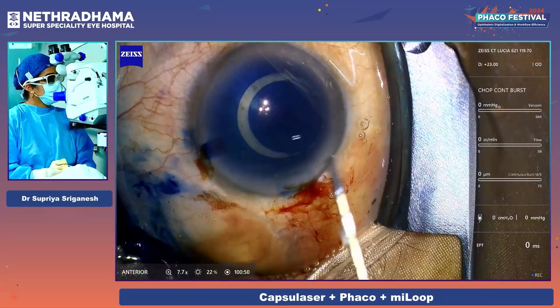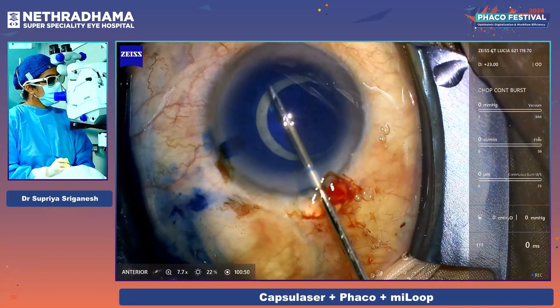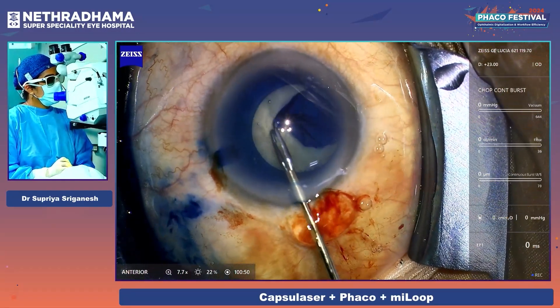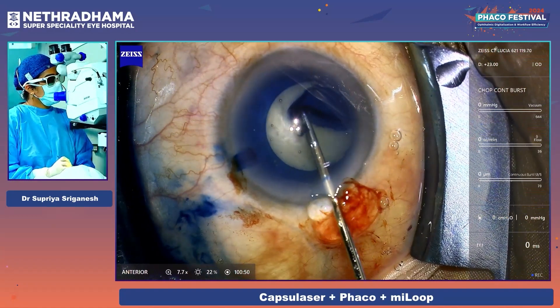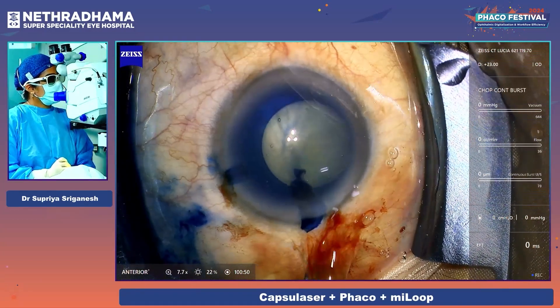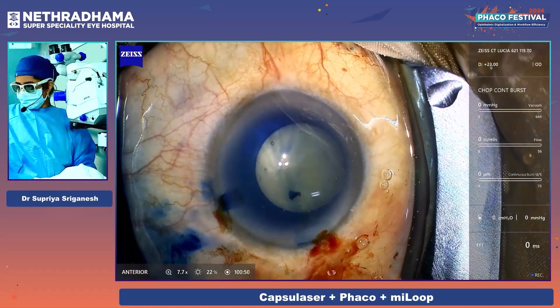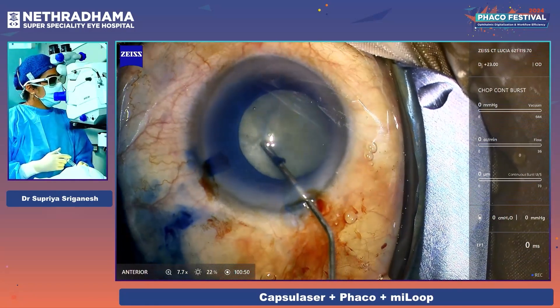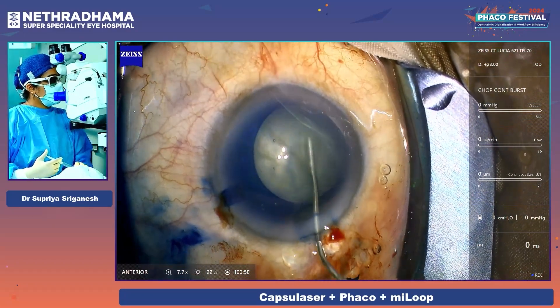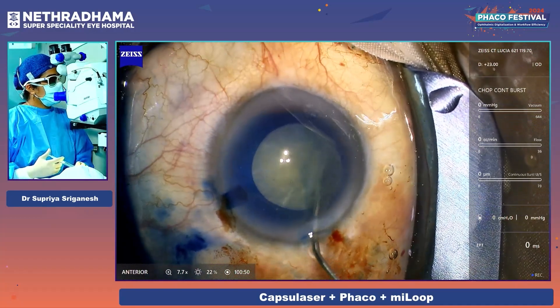It's complete. I'm just using a micro-rhexis forceps. The free-floating rhexis is slightly off-center, but this works. As you can see, the edges of this rhexis are much stronger than a manual capsulorhexis or a femtorrhexis. It's a freely rotating nucleus.